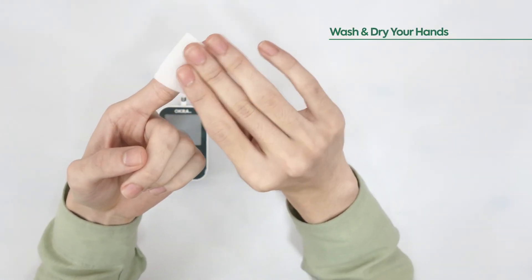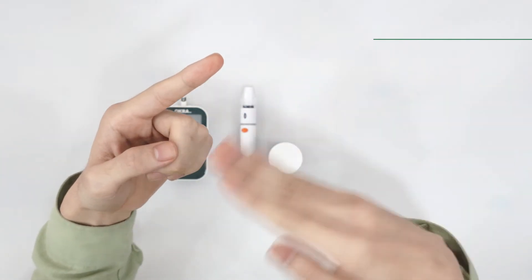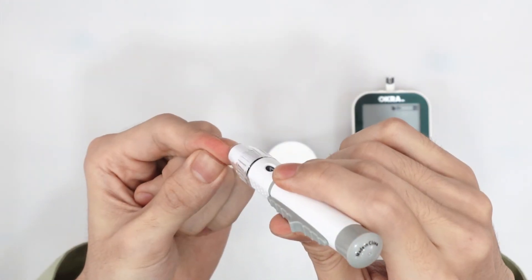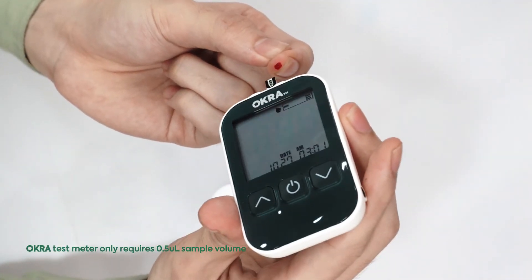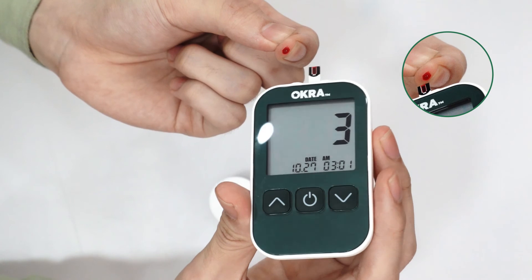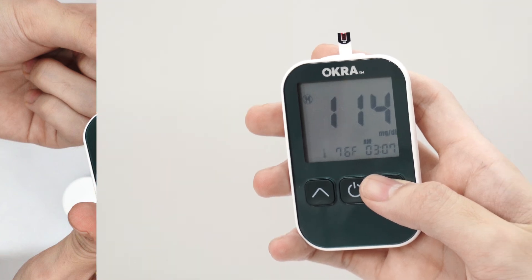Wash your hands with warm soapy water or with an alcohol swab, then dry thoroughly. Use the lancing device to obtain a drop of blood. Bring your meter to the blood drop and lightly touch with the contact window on the test strip. The meter will display your results in five seconds. Your testing is now complete.